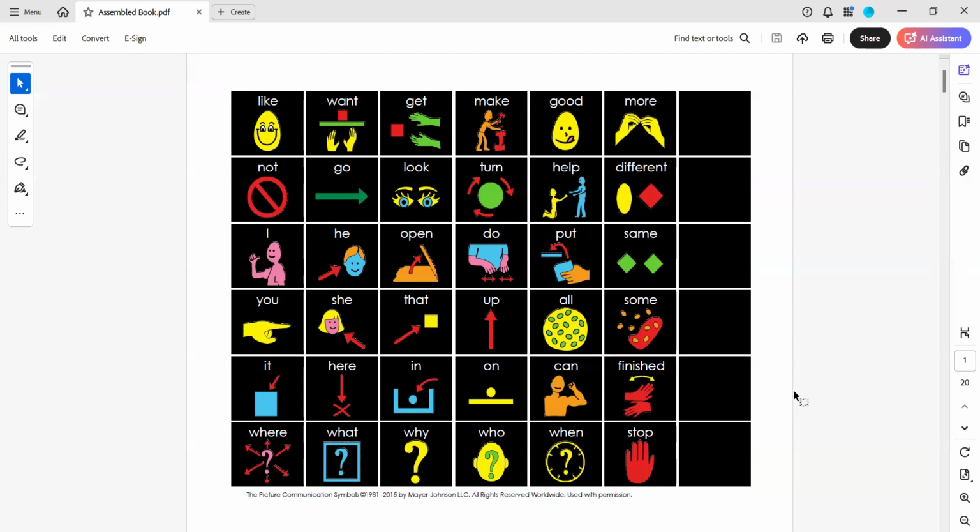So our client would benefit from using a Lite Tech AAC flipbook to support his participation in daily academics and socialization, both at home and at school. Due to the CVI, this flipbook needs to have high contrast symbols with bright colors and white text on a black background, such as we have right here. So we can see the black background, bright colors, white texts.